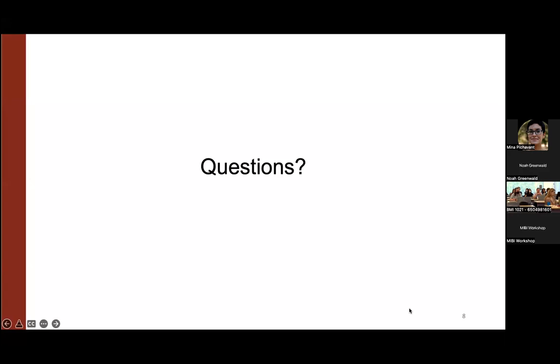Yeah, there's a couple of questions more like protocol detail. Maybe Mark, is it in the protocols.io, like how to add the EDTA? I don't know if we put that on there. If not, we can upload it, because there's some questions like, what's the concentration, what step. I think it would be good if we had the actual staining protocol. No, we don't have a protocol. I guess I think it's 100 micromolar, isn't it? 1 millimolar? Yeah.